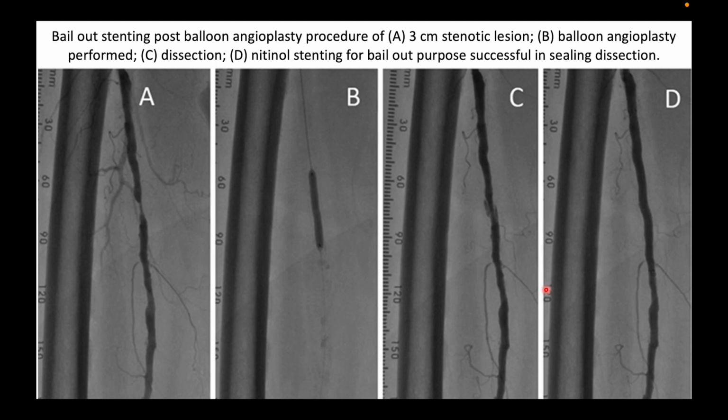Again, as I said, bailout stenting is done in this case only if there is a flow limiting dissection. This is the ballooning that has been done. There is significant dissection here and the flow was being limited and there was significant recoil after 10 minutes, so in this case it was covered with a small stent.